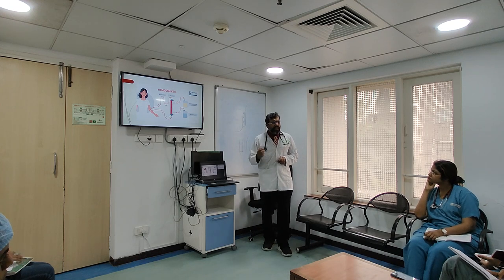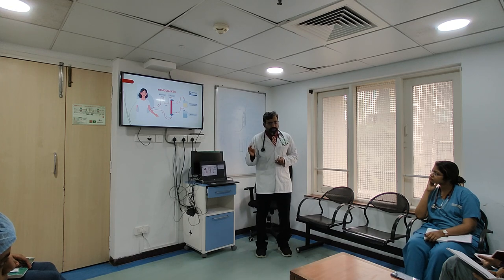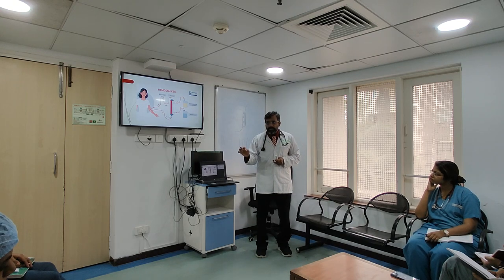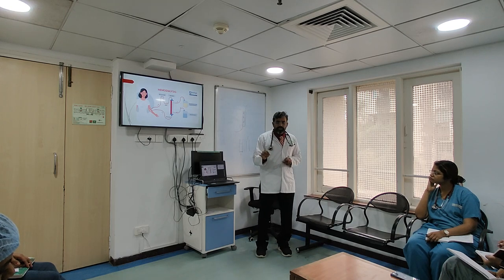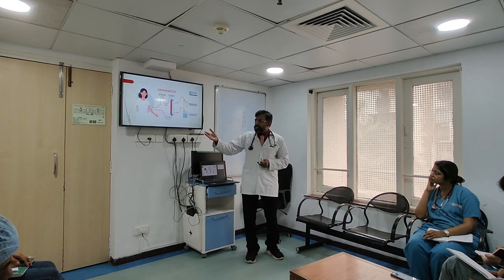They also have calcium, magnesium and sodium. The dialysate fluid has calcium, magnesium and sodium, all three, and these proportions are very similar to what you have in the plasma. The difference being creatinine and urea are not there. And when you say small molecules, these are the small molecules. She just mentioned small, middle and large molecules.